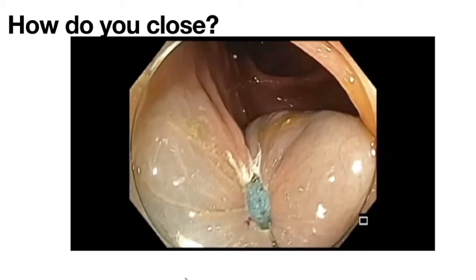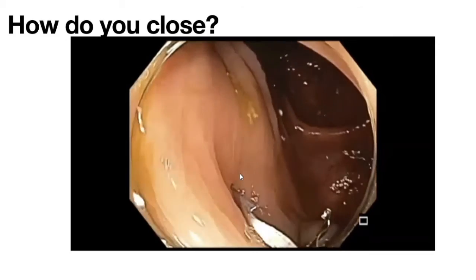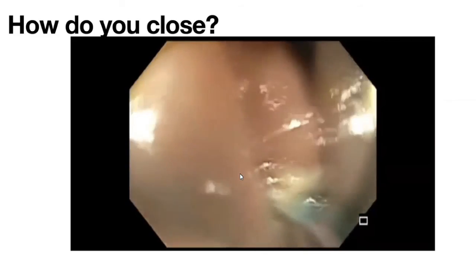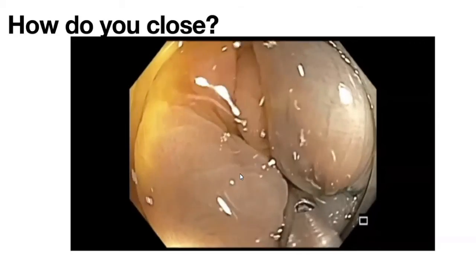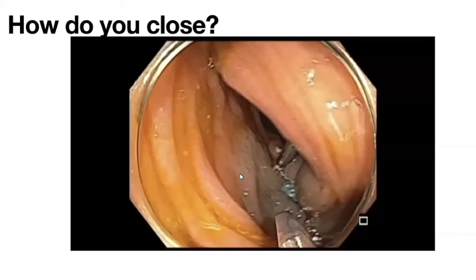Okay. All right. So because of the fact that he was in his late 60s, and the right side lesion size is not big, but because he's going to go back on oral anticoagulants, I decided to close, and this is what we did for the closure. And what I try to do is, whenever I close, to have a deep approximation of the edges, so that we could cut down the risk of delayed bleeding.